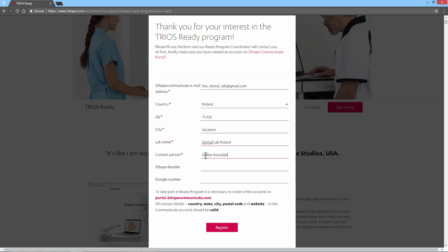You'll also need to have an active 3Shape dongle with relevant 3Shape software to sign up for the TRIOS Ready program. Once you're ready, click on the Register button to register.